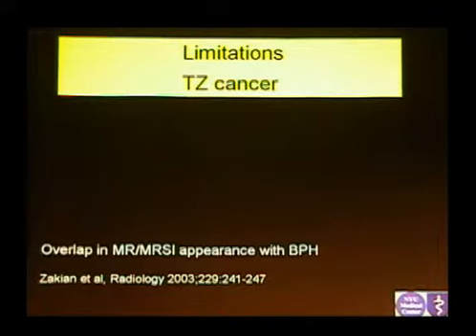Why would hemorrhage affect spectroscopy? Because the shimming is going to be very difficult. So shimming is difficult, you're going to get a lot of contamination, a lot of artifacts, and also it has been described in one paper that there is choline leakage if you have hemorrhage. So what happens, there are necrotic changes, and you can have some false elevation of choline. Sometimes you can get some good results.